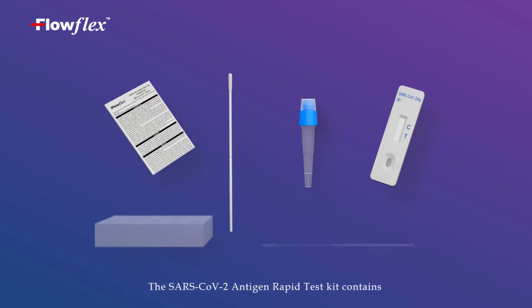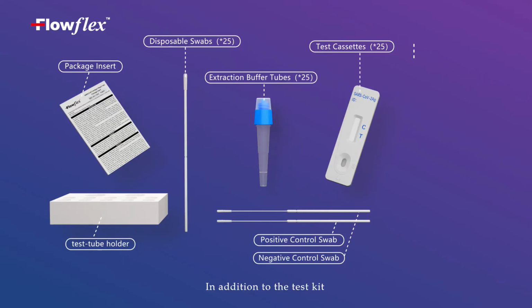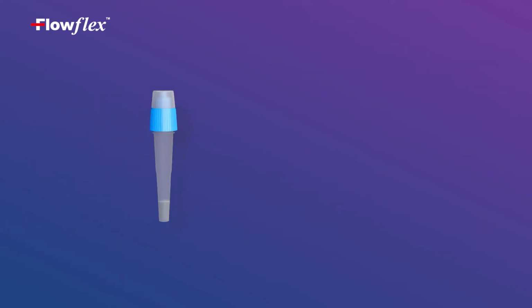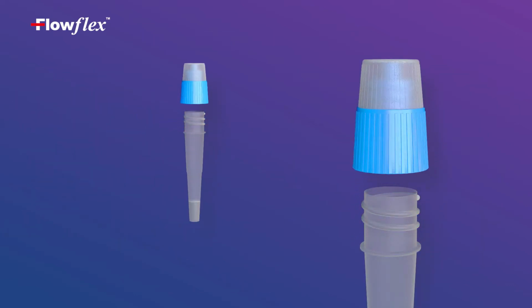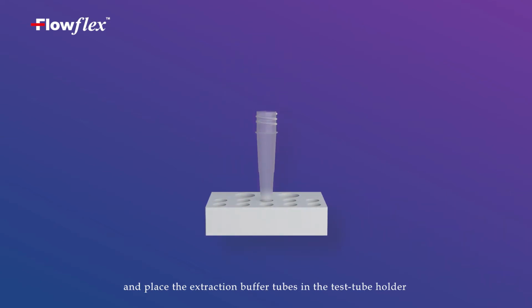The SARS-CoV-2 antigen rapid test kit contains the test kit. In addition, you would need to prepare your personal protective equipment and a timer. Remove the cap and place the extraction buffer tubes in the test tube holder.